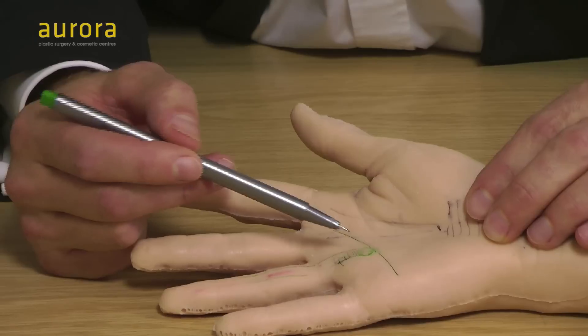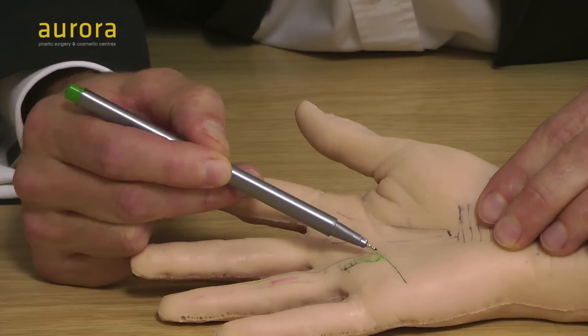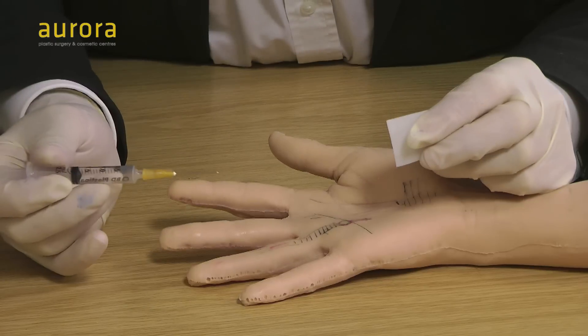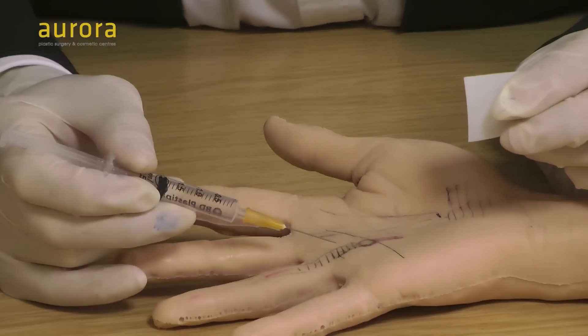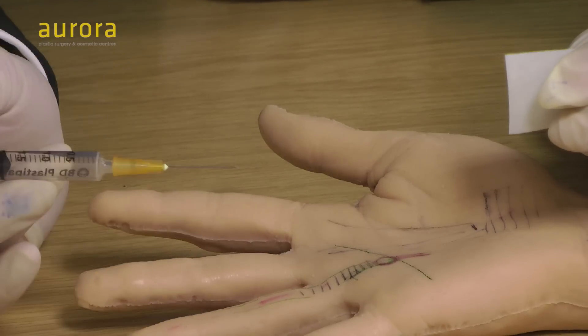The swelling is caused by synovium on the outside of the tendon, and that's what we want to reduce. By reducing that, we're going to let the tendon slip freely in and out of that tendon sheath. Trigger fingers can occur in any of the fingers — the most common is the ring finger — and can also occur in the thumb. I'm going to show you how to do a steroid injection to help trigger fingers. We couldn't get anyone in the office to have a hand injection, so I'm doing it on our model hand here, aiming to get the steroids around the tendon. It doesn't have to be within the flexor sheath in the A1 pulley, because you can get ganglions if you go through there, so I'm going to aim to get the steroid just around the nodule.